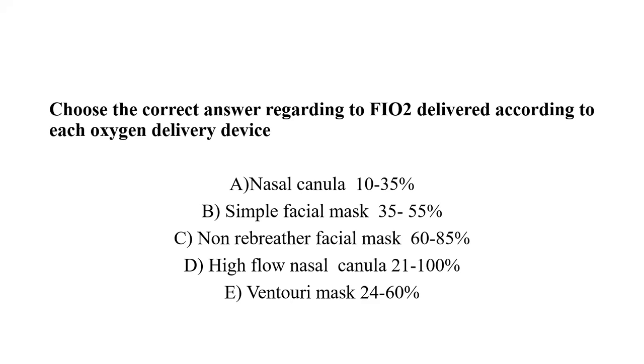Okay, we will discuss after. High flow nasal cannula, 21 to 100. True. Venturi mask, 24 to 60%. True or false? I'm not sure.